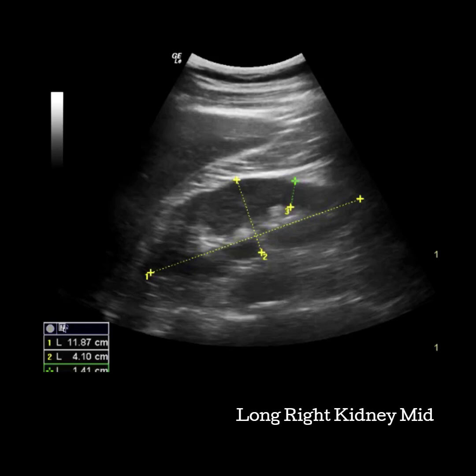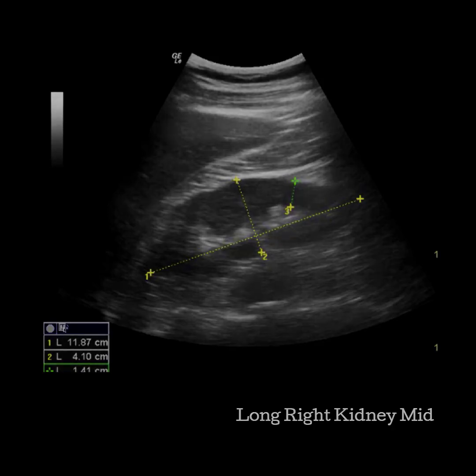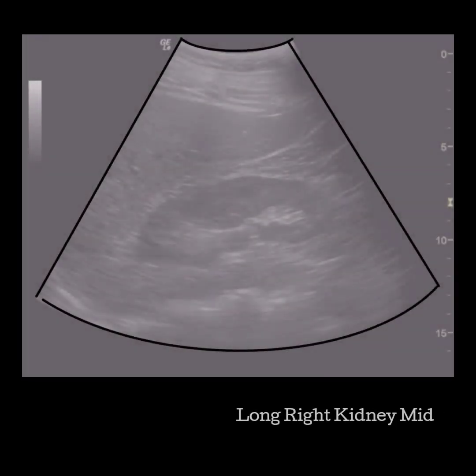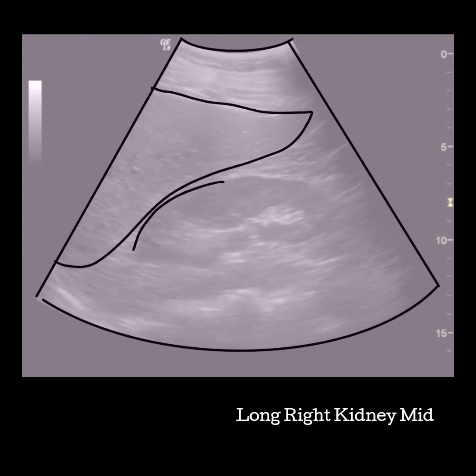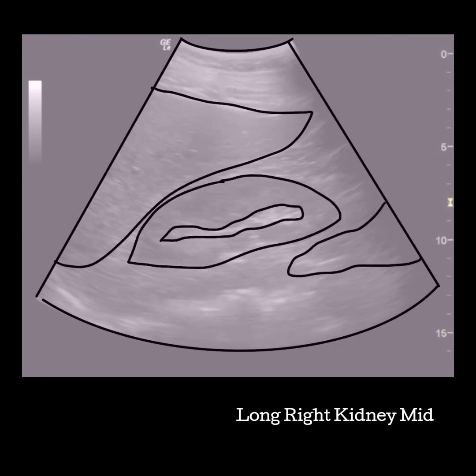You may also need to measure the cortex in this image. The liver should still be seen superior to the kidney. The psoas muscle is inferior to the kidney. Make sure that you heel-toe your transducer to make the kidney as horizontal in the image as possible. Compare the echogenicity of the kidney to the liver; the cortex should be more hypoechoic compared.